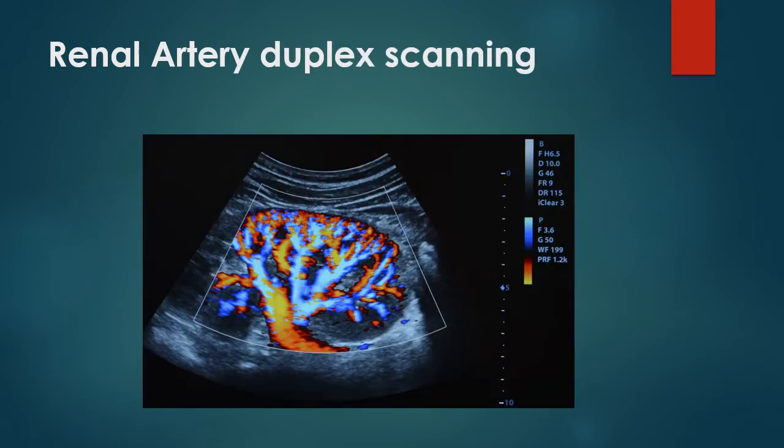Here is a beautiful image of the renal artery duplex. You can see the main renal artery, the segmental artery, the arcuate, and the interlobar artery within this kidney.